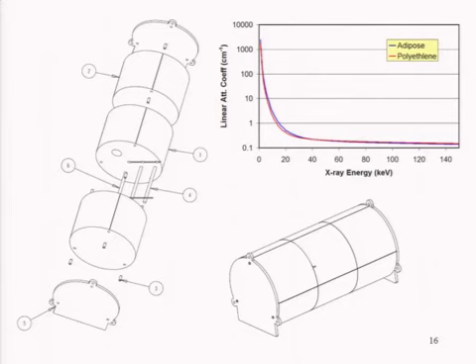I'll just point out that it's 30 centimeters in diameter, and not 32, and it's made of polyethylene. It's not made out of polymethyl methacrylate. Polyethylene is a very close surrogate to adipose, so it's not water equivalent. That would be nice, but we're also striving to achieve a certain economy here. A water equivalent phantom that's solid, you know that solid water is exceedingly expensive to manufacture. This is an extruded material that's relatively inexpensive, and as the population becomes a little bit more obese, adipose is probably a better surrogate than water anyway.